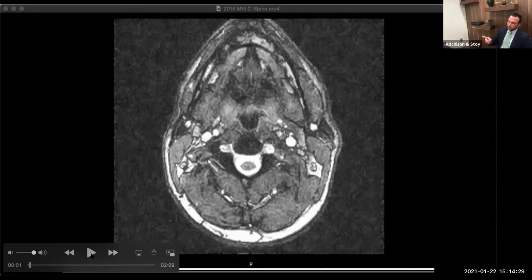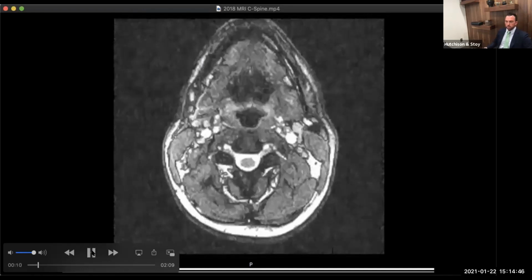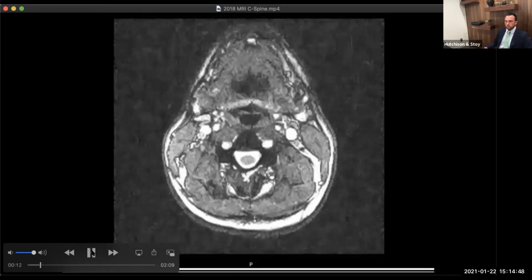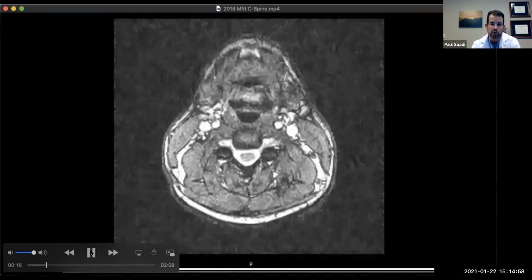Okay. For the record, I'm going to introduce this, or attach it, to this deposition as Exhibit MR20. I'm going to hit play, doctor. Bear with me, it's slow. You tell me when to stop. I don't really use play, but you can keep on going. This is going from the base of the head down to the shoulders with individual cross-sectional cuts through the neck. Okay. If that makes sense.